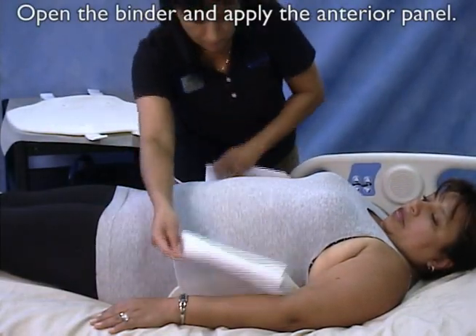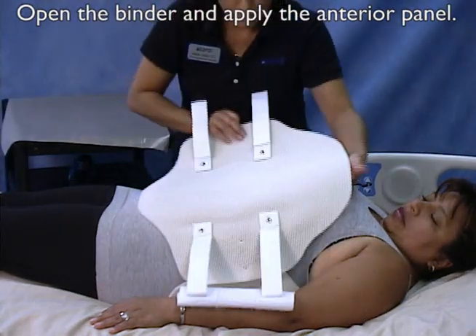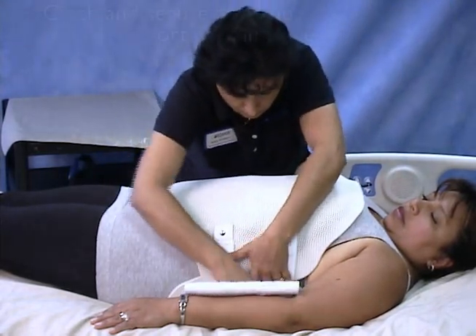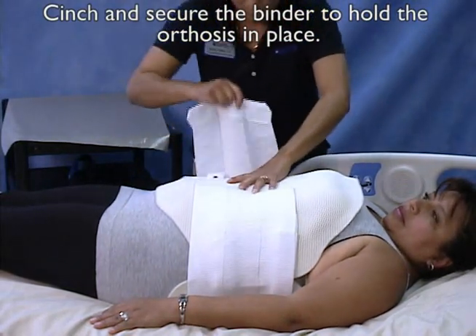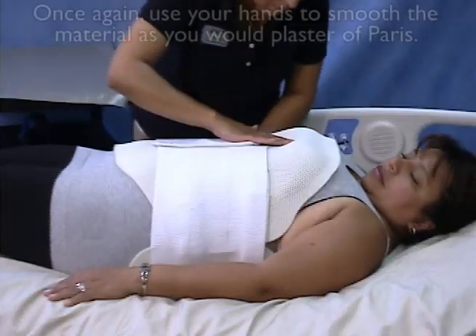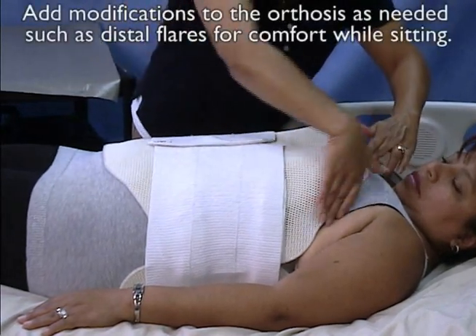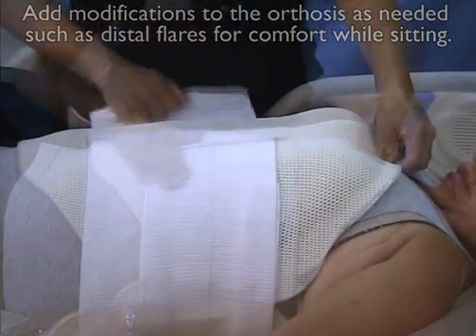Open the binder and apply the anterior panel. Cinch and secure the binder to hold the orthosis in place. Once again, use your hands to smooth the material as you would plaster of Paris. Add modifications to the orthosis as needed, such as distal flares for comfort while sitting.